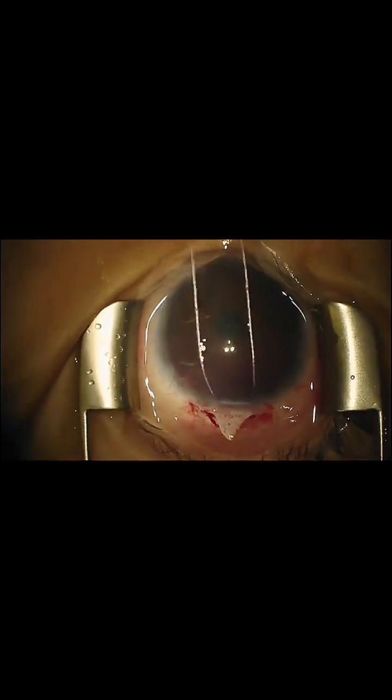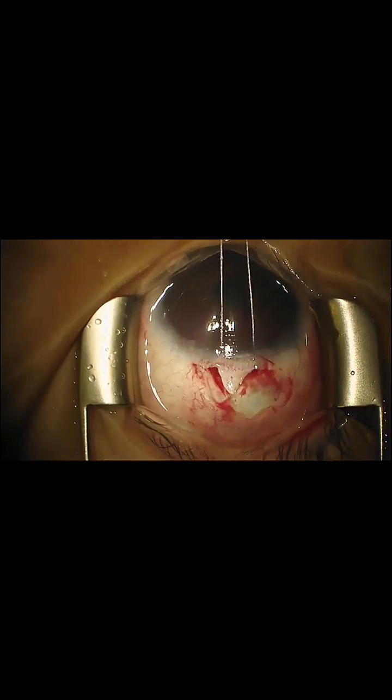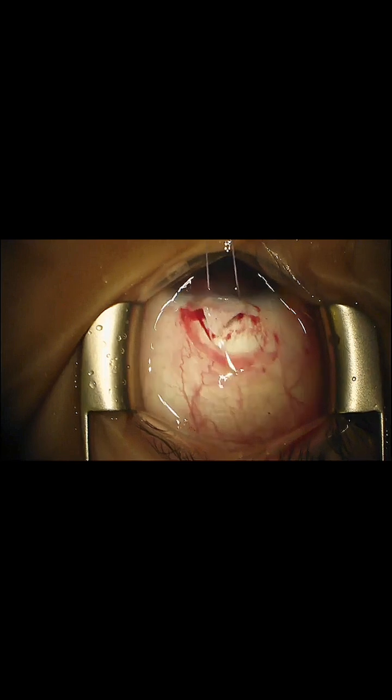And I'm going to put my traction back on. I'll take the 9-0 nylon. There's really not much resistance when you do that.